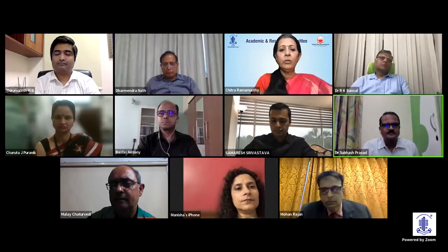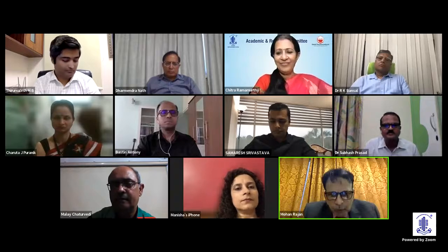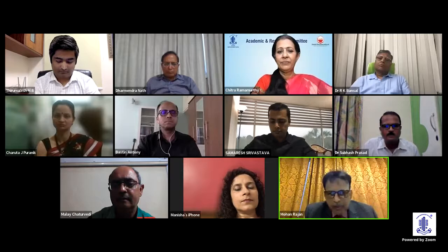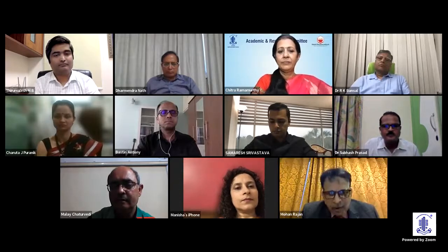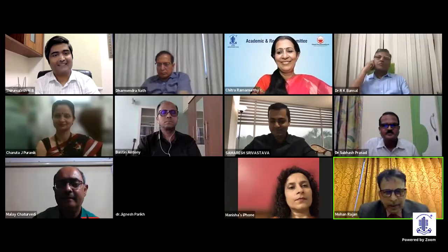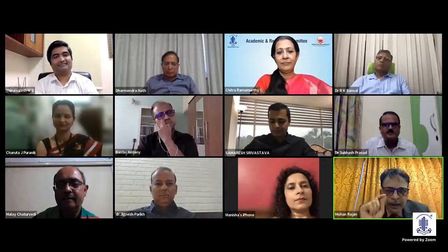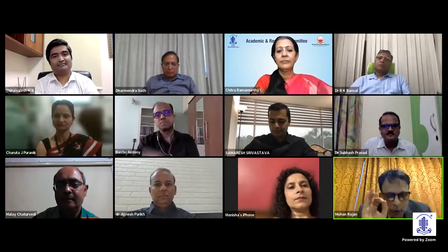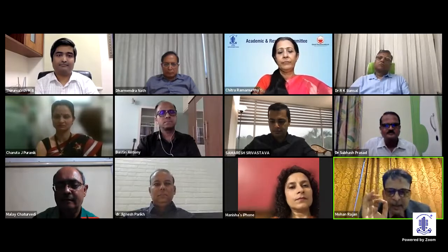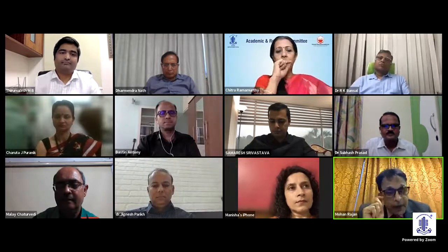Dr. Mohan, what are your thoughts? I think it's a beautiful video. Subhash, beautifully managed. The only message I want to give everybody, because I've got probably one of the largest complications with IOL implantation, you must have seen my videos on IOL antics and acrobatics, is that whenever there is a resistance while implantation of the lens, please don't use that lens. Come out of the eye and maybe re-examine the cartridge or change the cartridge or do something different. Don't try to push this lens inside.